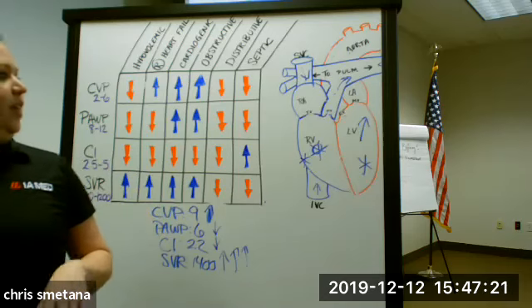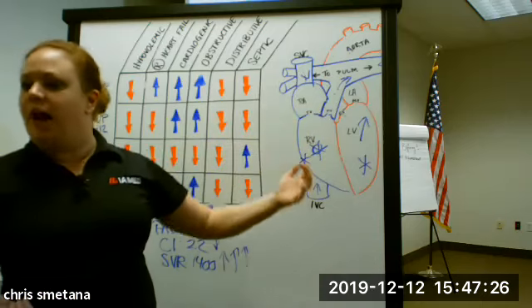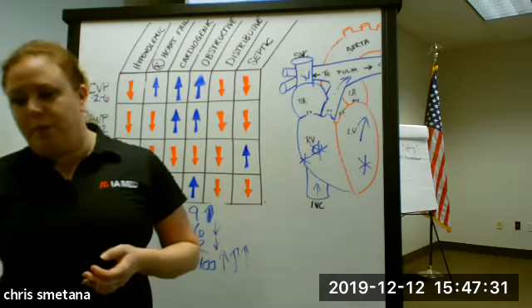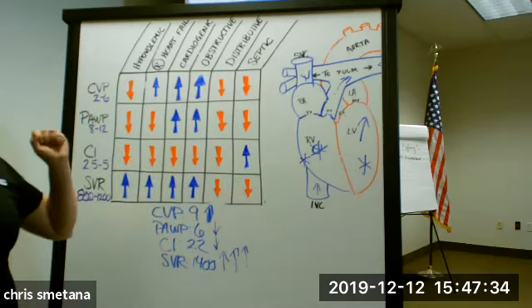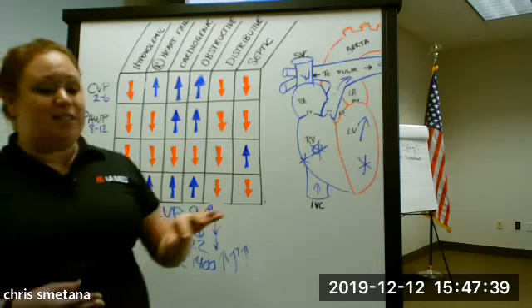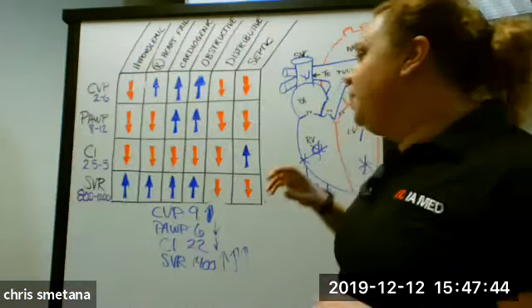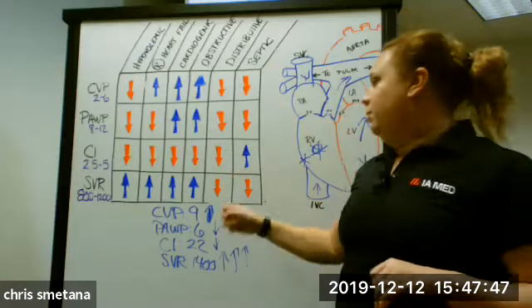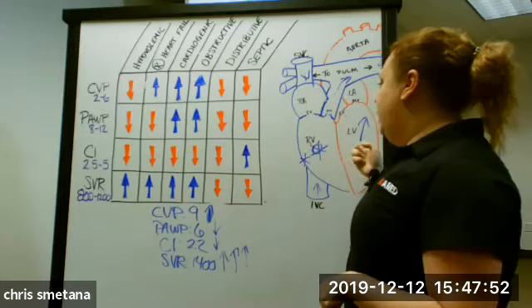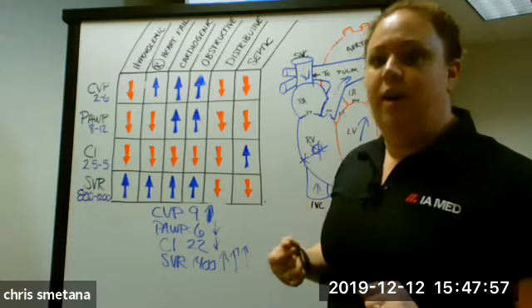Like I said, don't panic about things. If you can just conceptually think about where blood's flowing and where the blockages are, then it's going to make it a lot easier. I think this is something that a lot of people really panic about, and they look at these numbers and they're like, I don't even know what we're looking at. I don't know what all these values mean. I didn't even realize there were all these different systolic and diastolic pressures that I have to be paying attention to. But if you break it down and just say, where's my problem? Do I have a problem feeding in? Do I have a problem going out? Do I have a problem in the lungs? Is my left ventricle tanked, or is my body not responding properly? That will really lead your way.